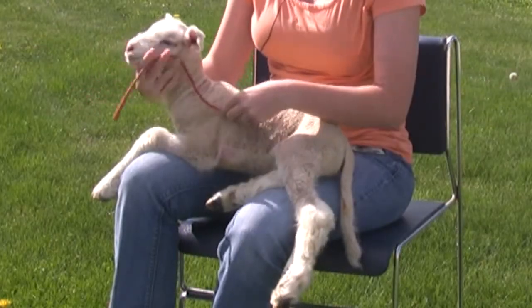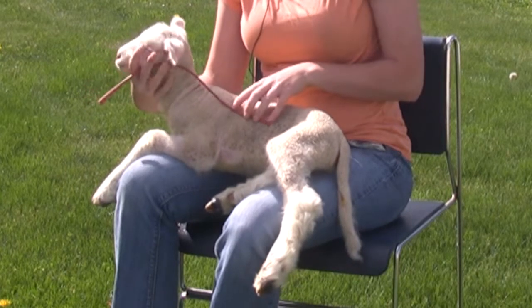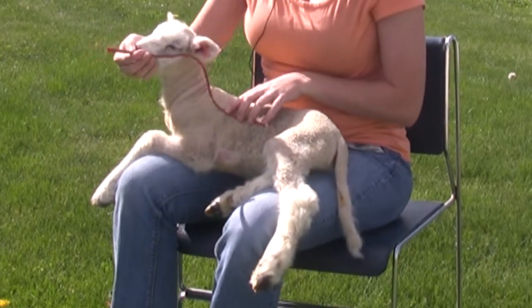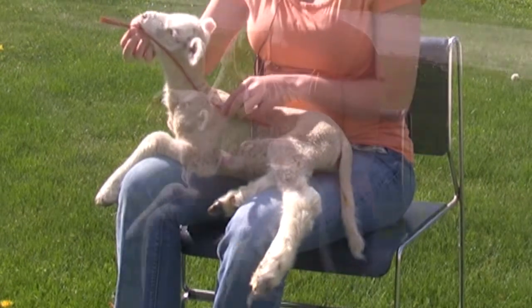To determine how far in the stomach the tube must go, lie the tube along the lamb's body so that it reaches the last rib. This will give you a reference point on the tube when you insert it and begin feeding the lamb.